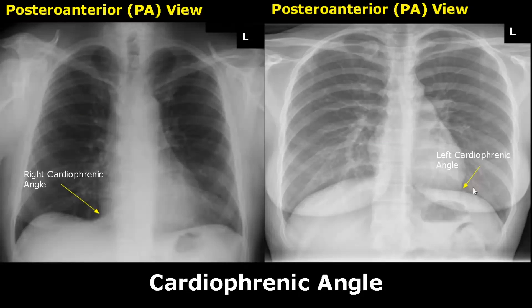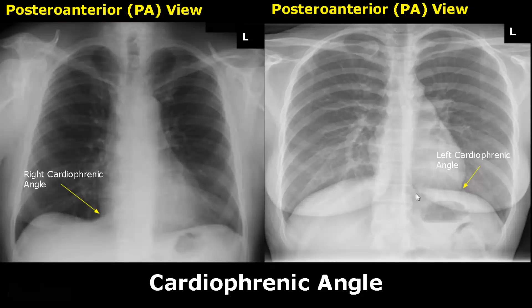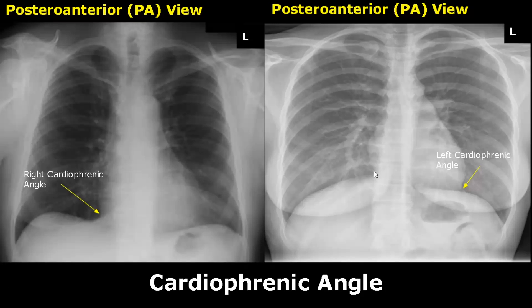The cardiophrenic angle is the angle between the heart and the diaphragm. There are two cardiophrenic angles — this is the right cardiophrenic angle and this is the left cardiophrenic angle.